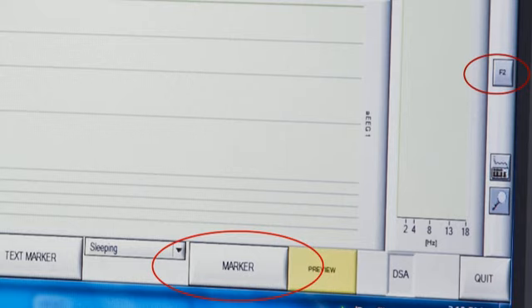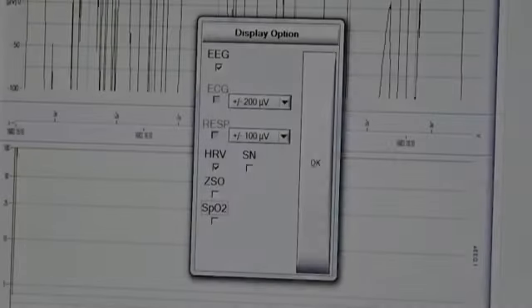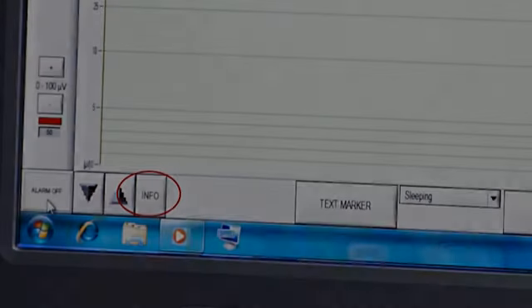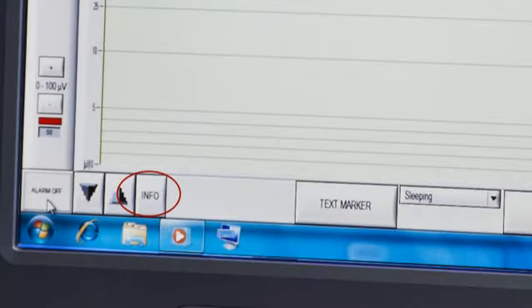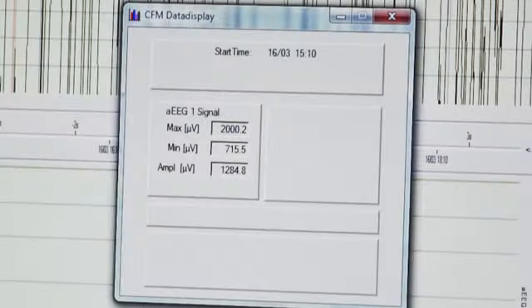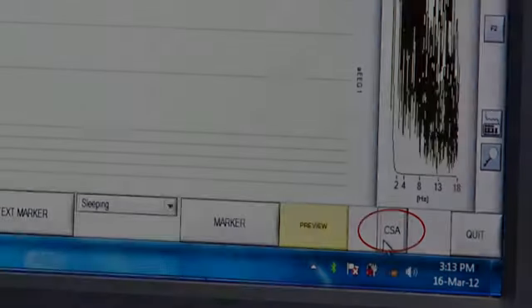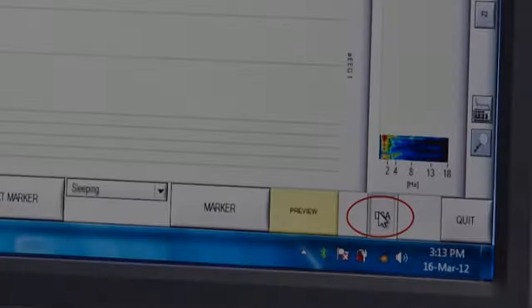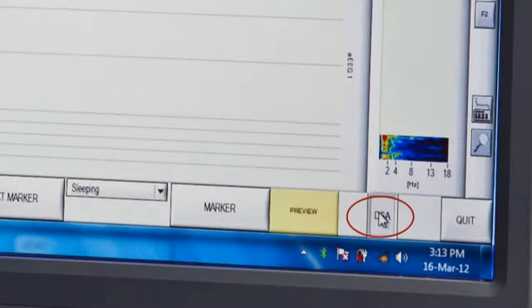To view the other parameters activated in the setup menu, click on F2. You can add them to the screen by checking the box or remove them by unchecking the box. Click on information to see the numerical data. You can click on CSA or DSA to switch between compressed and density spectral array.